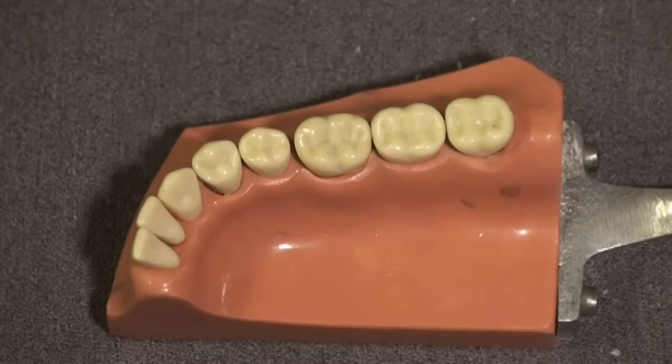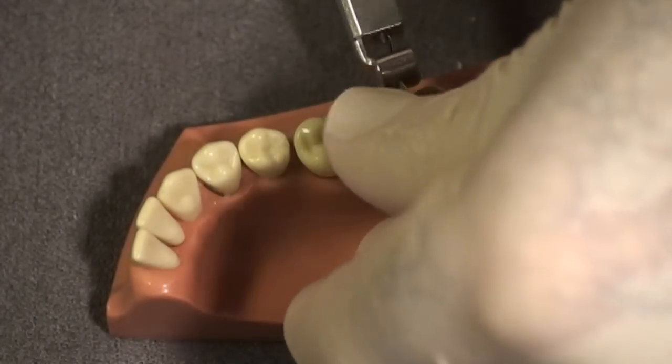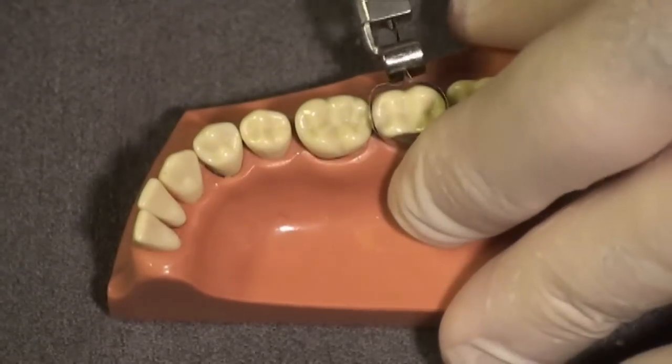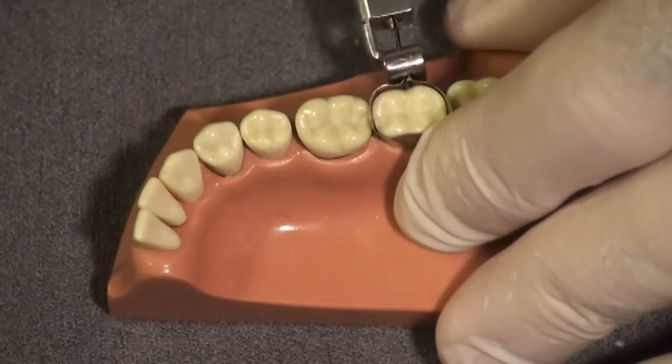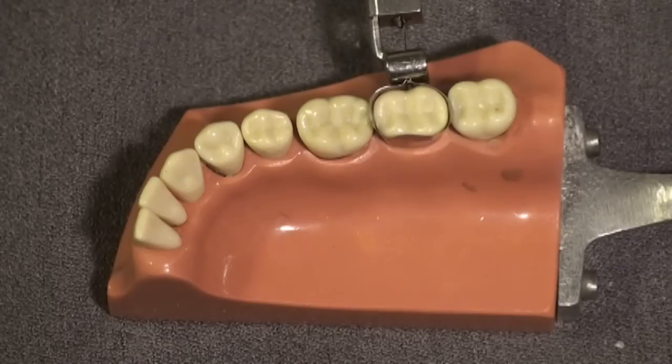We have just anesthetized the patient and we're going to place a matrix band on this tooth as we would later on in the procedure and tighten it as we normally would. No wedge is needed at this time.